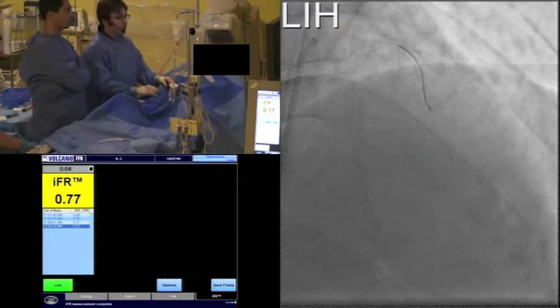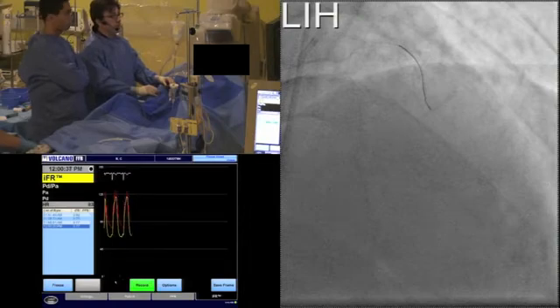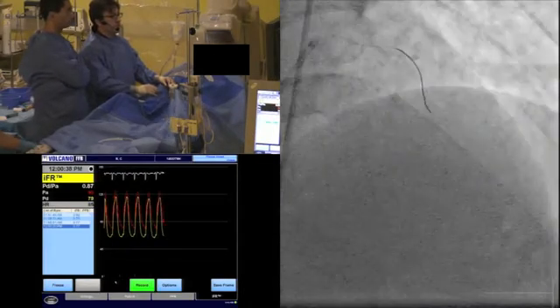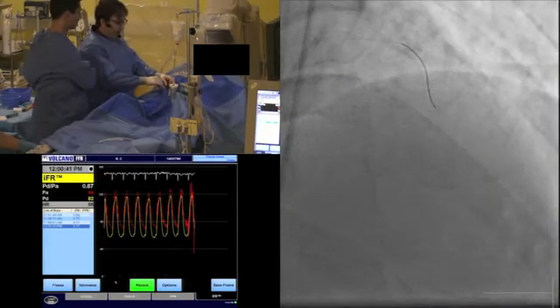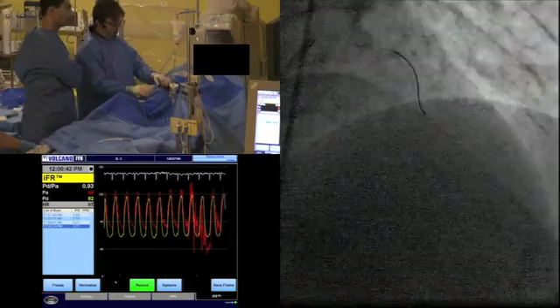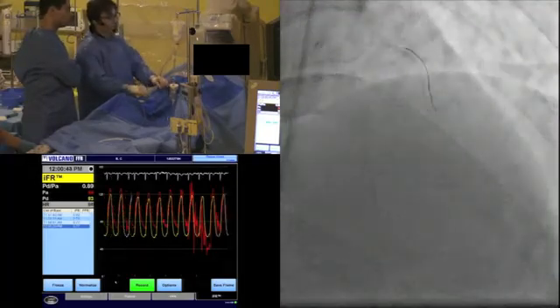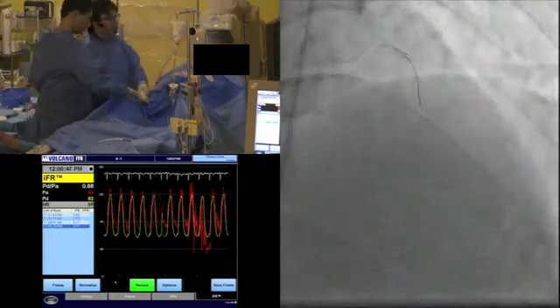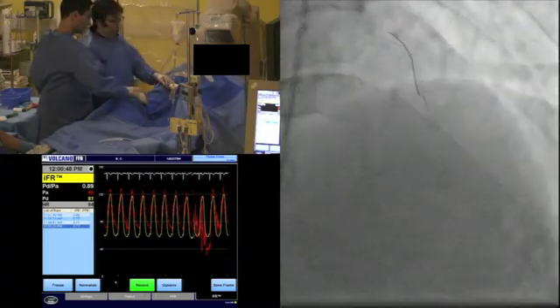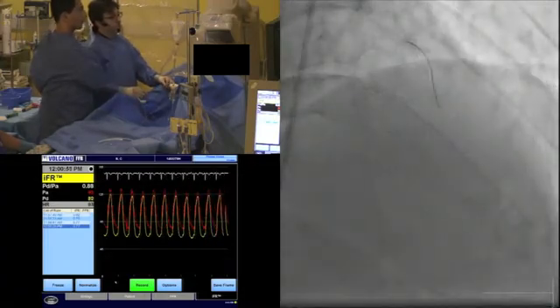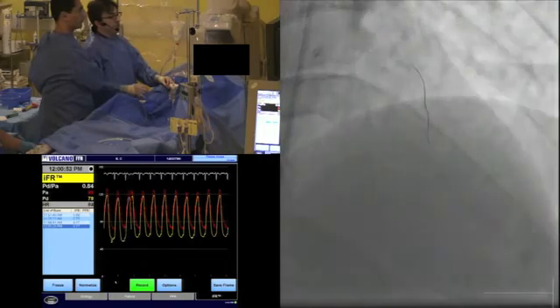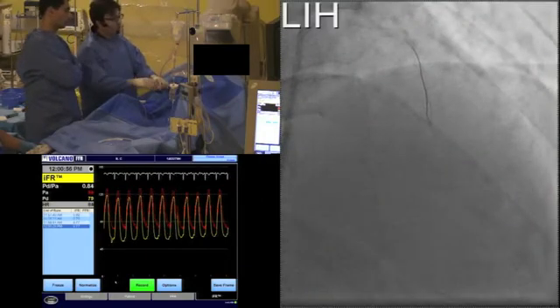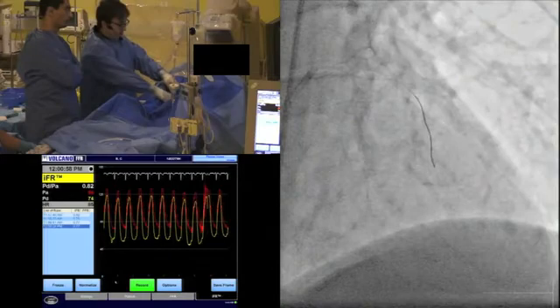And can we just do a fluoro record there, please, Julius? Okay, so I'm just documenting the position of the wire. Now, really, I'm quite proximal in this vessel. So I'd only anticipate that if we go further down here, we would see more of a pressure drop. So I'm just going to advance down here very carefully.